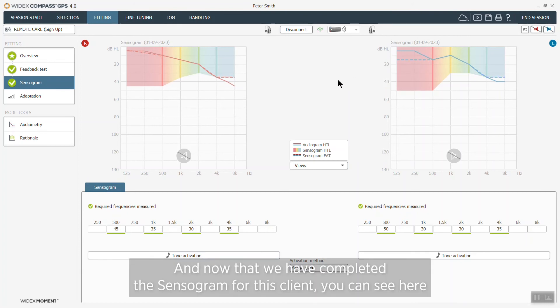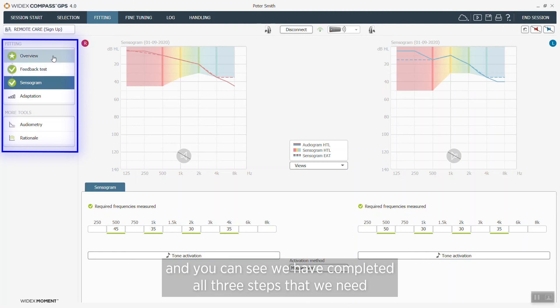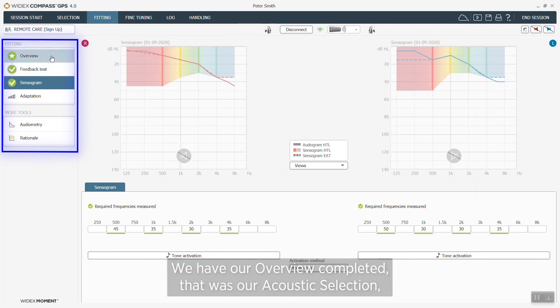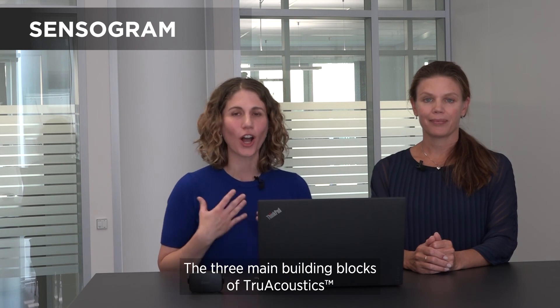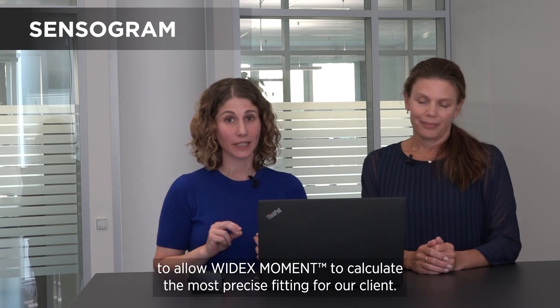Now that we have completed the sensorgram for this client, you can see here we have a green check mark next to sensorgram. In fact, you can see we have completed all three steps that we need for true acoustics to calculate a very precise fitting. We have our overview completed — that was our acoustic selection — we've completed the feedback test, and we have completed the sensorgram. So the three main building blocks of true acoustics allow Widex Moment to calculate the most precise fitting for our client.